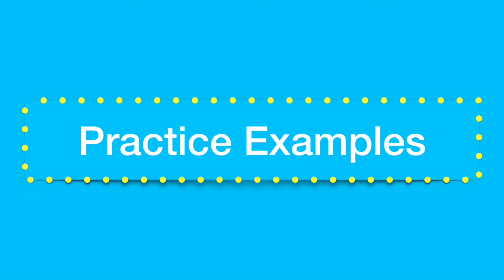So we have a few practice examples to go through to just kind of reinforce the lesson. If you need to pause the video, feel free to.